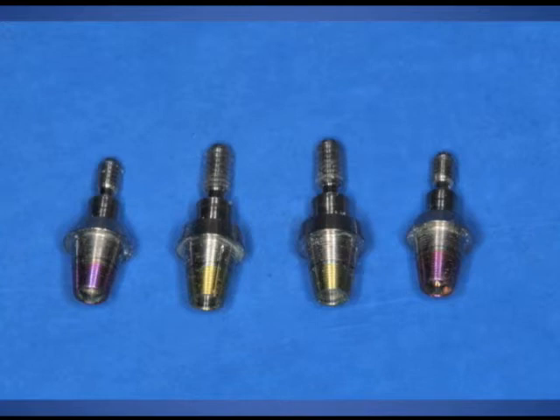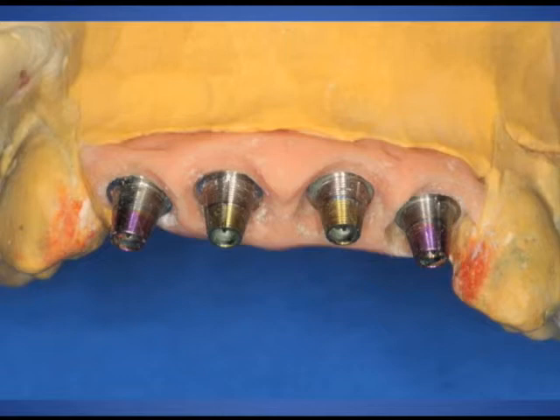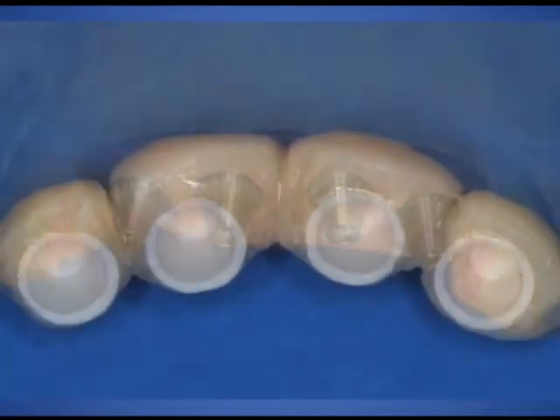We would use transitional abutments in this situation. You can see they're conical in shape, which would allow us to place our final transitional splinted crowns the day of surgery. So these are transitional Nobel BioCare abutments that, again, this is all done preoperatively by the dental laboratory. They are determining ideal position for ideal final aesthetics of the final crowns.